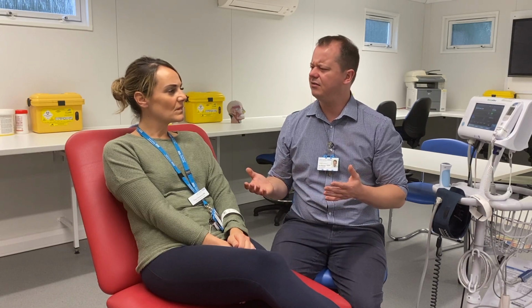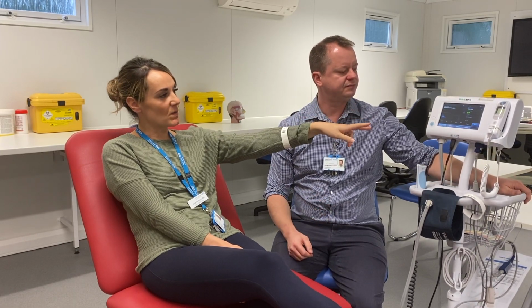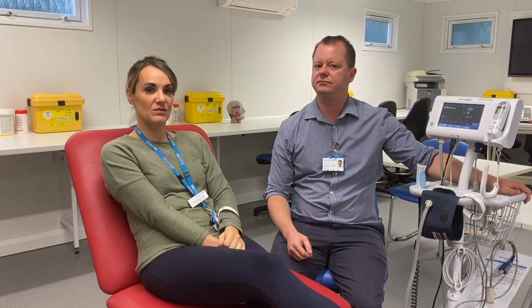Okay, anything I've forgotten? No, just saying if the pulse is irregular, it might sometimes pick up on the machine, so the pulse rate just might be a bit all over the place, and you'll see it where Tom pressed earlier on the trace. If there's any doubt, just have a good feel of the pulse as well.